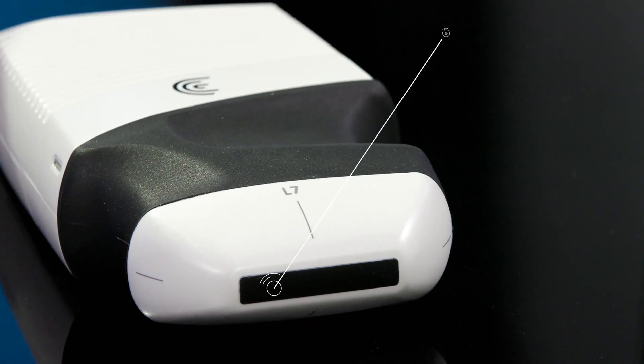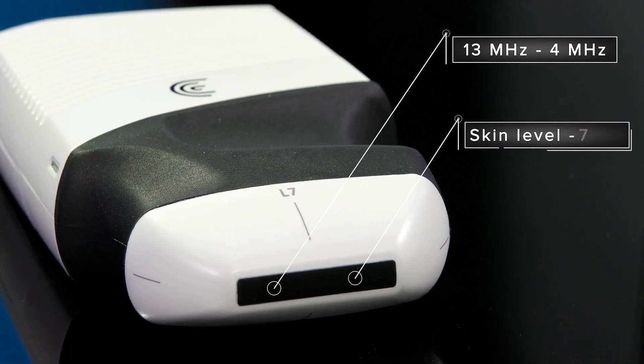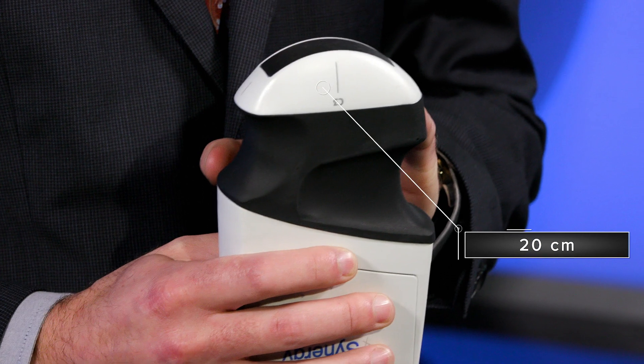The linear scanner is designed to provide a range of 13 megahertz to 4 megahertz for optimal scanning from skin level to 7 centimeters. If more depth is required, the curvilinear is available for scanning up to 20 centimeters.